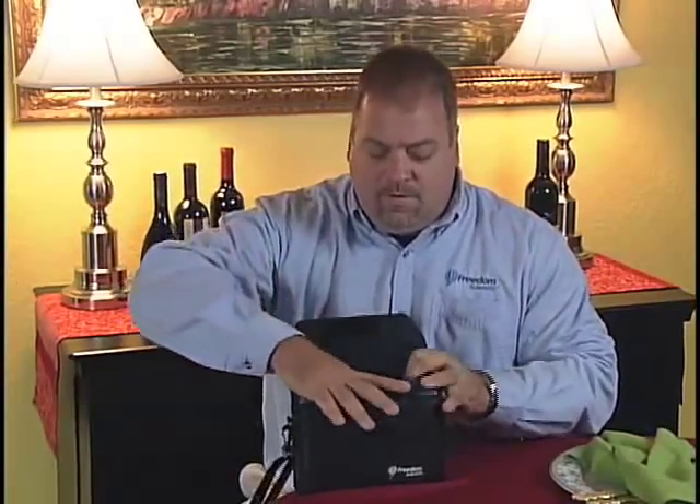It closes to protect the screen and automatically turns off to ensure that you receive 4 hours of real usage per charge. I don't go anywhere without it.